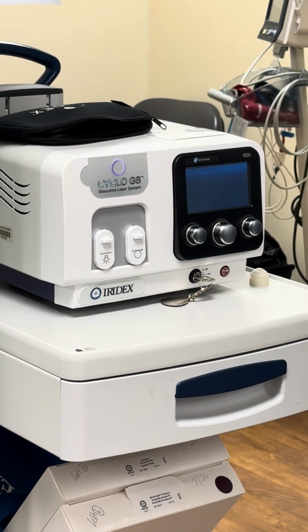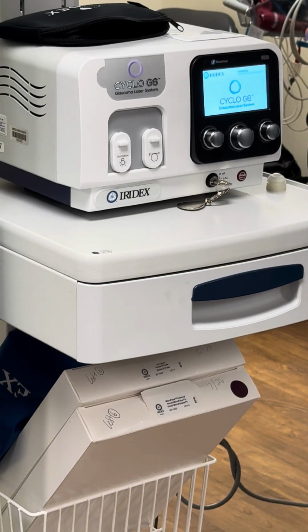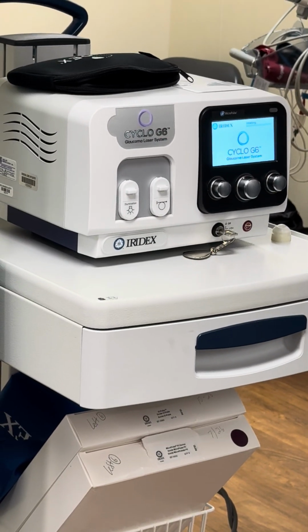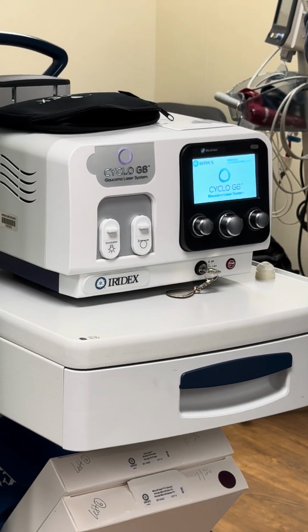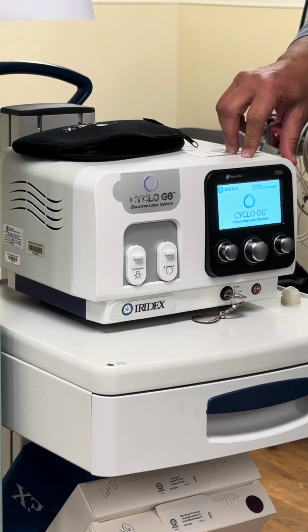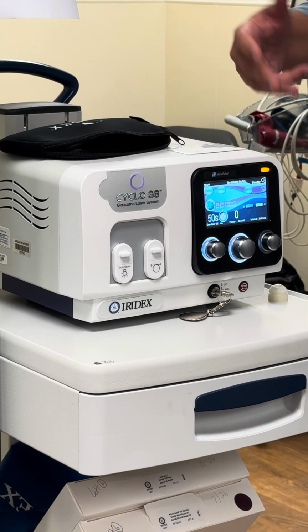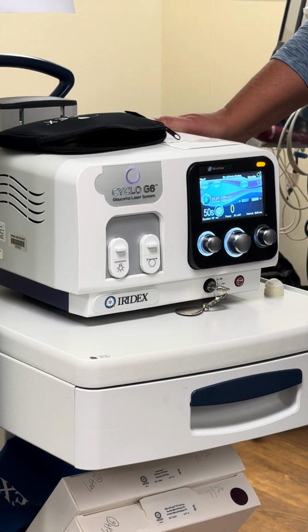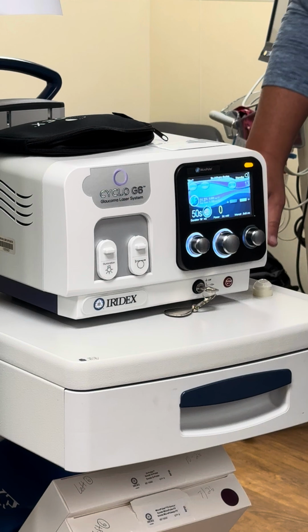Now, each of the boxes of probes are labeled. One's G probe, one is micropulse. So in the event that the doctor wanted a micropulse and you accidentally put in the other probe, it's going to recognize that, hey, this is not the correct probe for what you set it up for. You'll just have to open up another probe and put the proper one in.